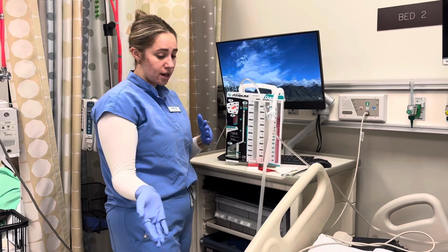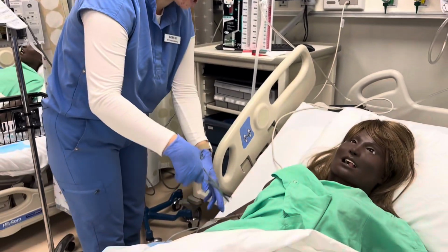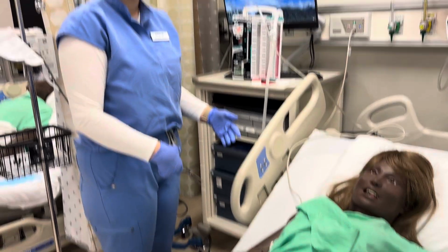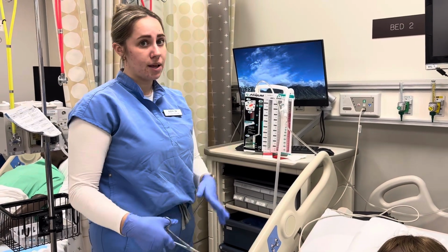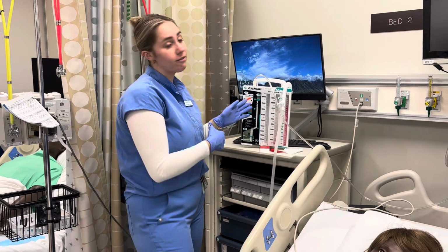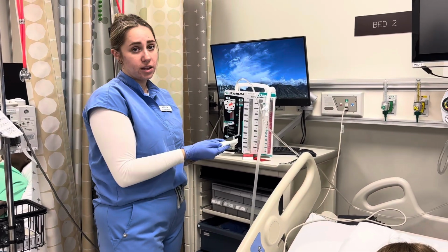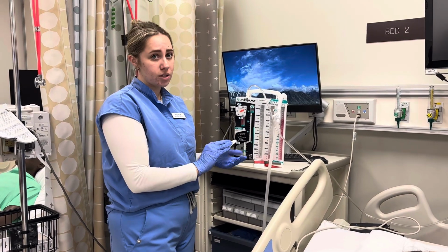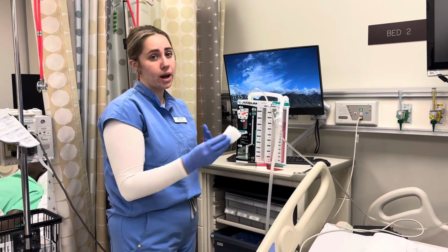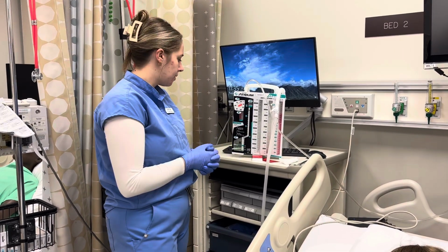So if there is any problem with over bubbling, we troubleshoot by using this clamp and starting at the patient and working down at 10 centimeter intervals, only clamping for a few seconds. And if it stops bubbling, that means that it's working properly, and we go until we find where the leak is. We also will have Vaseline and gauze at the bedside where we place over the tubing to close that leak just temporarily until we're able to get that changed and new tubing provided.